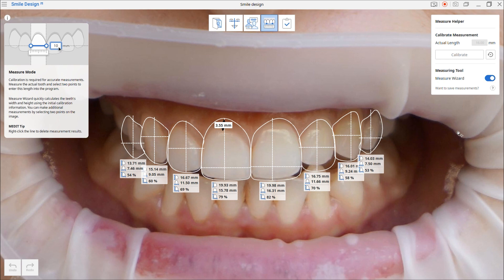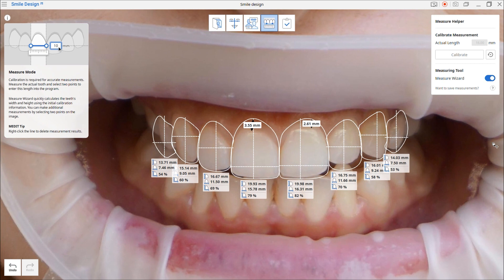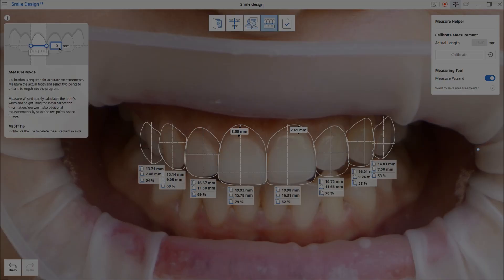Select two points along the image you'd like to measure to make manual measurements. Turning Measure Wizard off will hide the automatic template measurement results. To save the measurement results, click the camera icon to save your measurements as a screenshot.